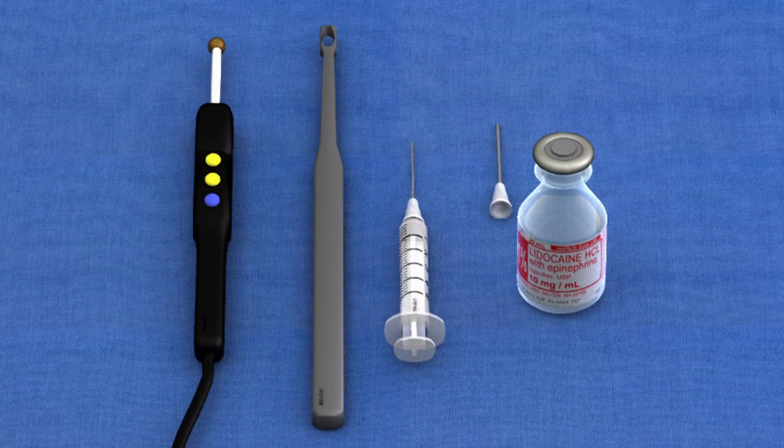The equipment consists of a skin curette and an electrosurgical device that is capable of cautery. Either a ball tip electrode or a blunt tip electrode can be used for the cautery phases.